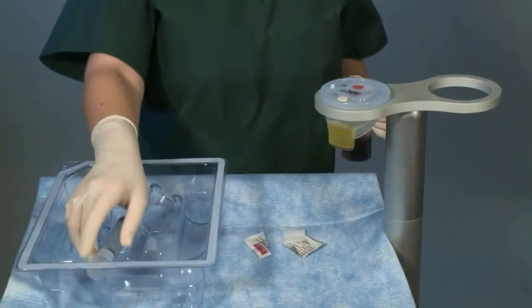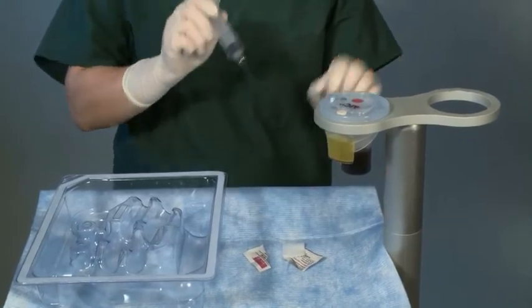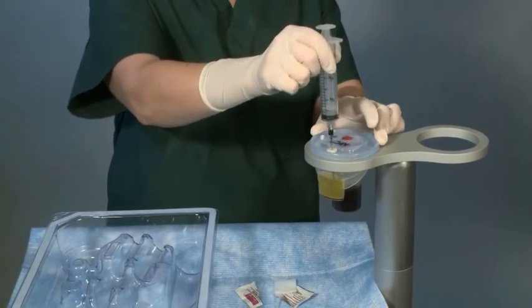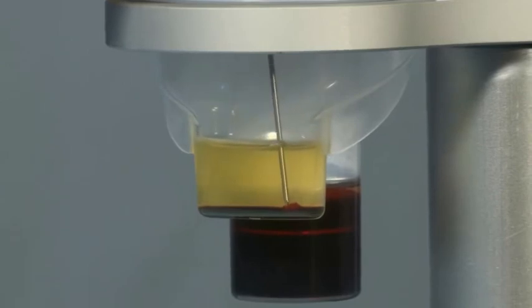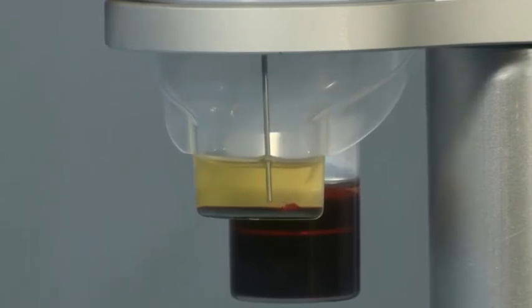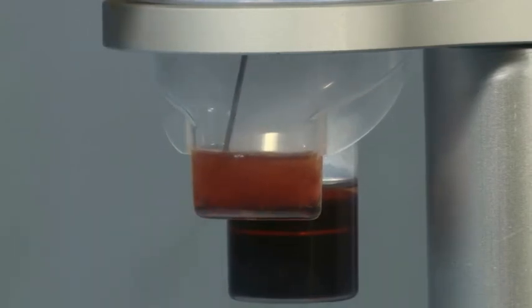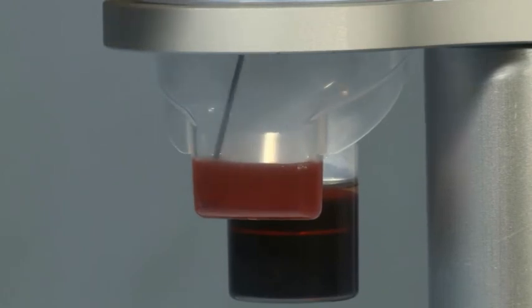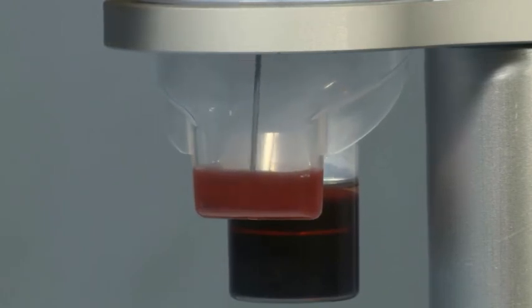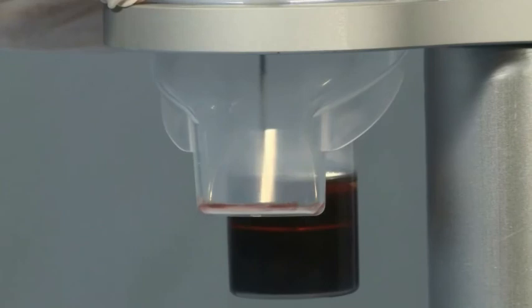To re-suspend the platelets, use the platelet concentrate syringe with blunt needle and no spacers. Remove the protective sleeve and withdraw the remaining platelet-poor plasma and platelet concentrate. Gently aspirate and express the concentrate in and out of the syringe into the plasma chamber, flushing along the wall of the chamber. Do not use excessive force so as to avoid foaming and platelet activation. Repeat this process two to three times until the platelets have been visibly re-suspended in the plasma and the white halo buffy coat that lines the wall of the plasma chamber above the red cells has been removed.